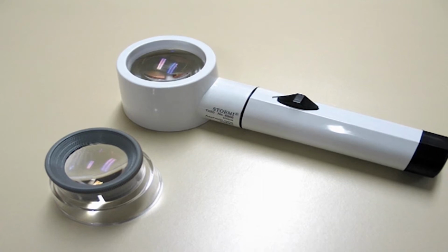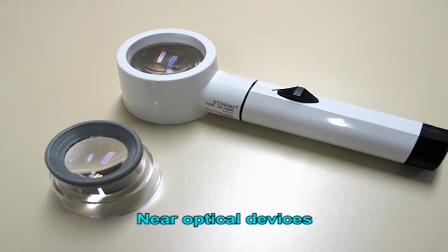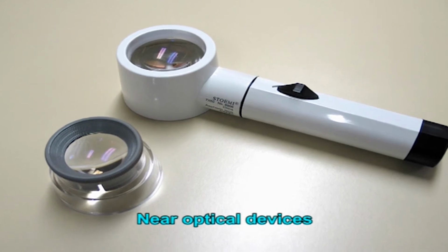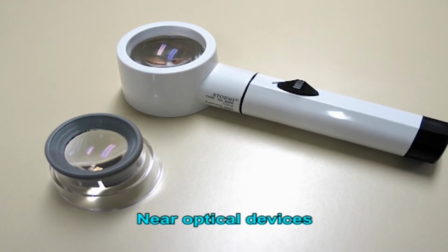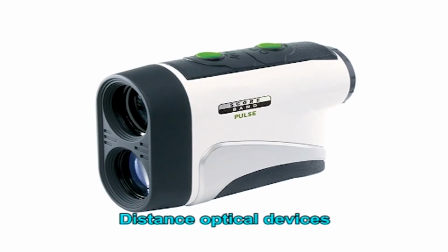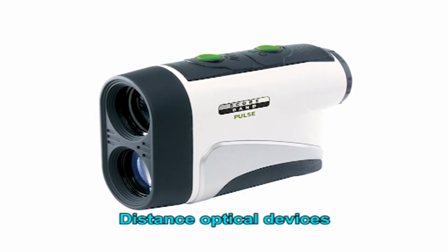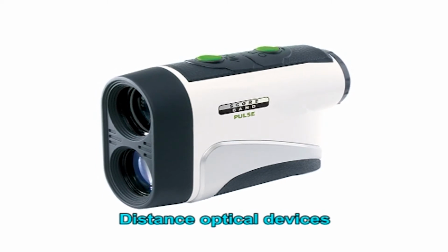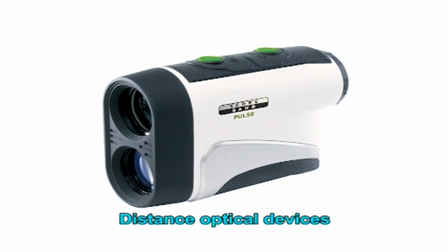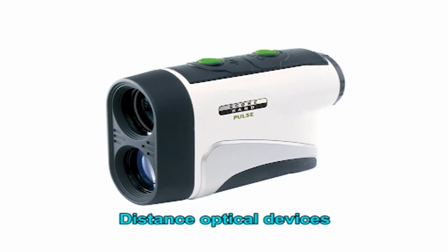Low vision optical devices can be grouped into two basic categories: near optical devices for activities such as reading, sewing, writing and crafting; and distance optical devices for activities such as attending movies and sporting events, reading street signs and price tags and identifying numbers on buses and trains.